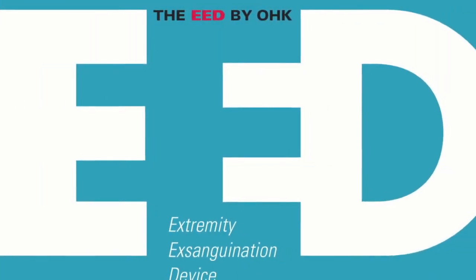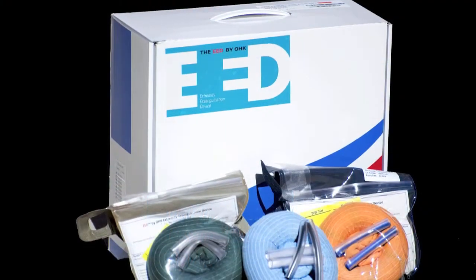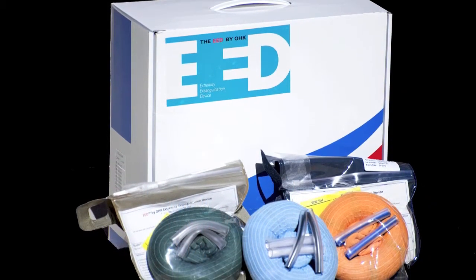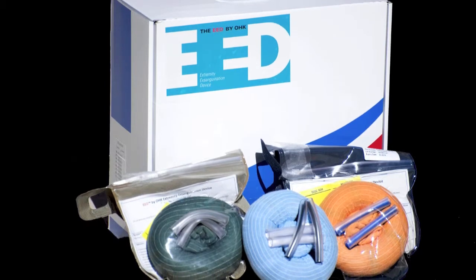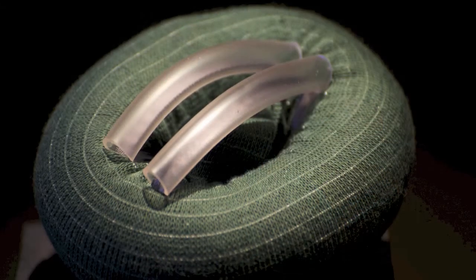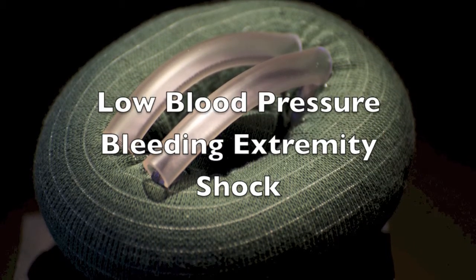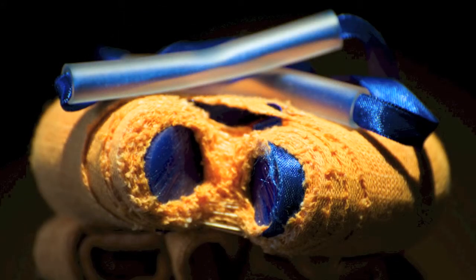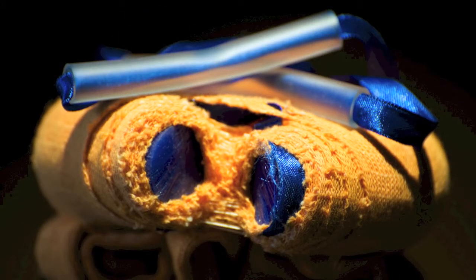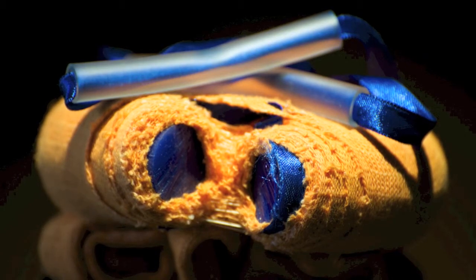Welcome to the Extremity Exsanguination Device, or EED, instructional video. The EED is a non-pneumatic tourniquet and is indicated for displacing the patient's own blood from the limbs to the central circulation and blocking the arterial flow into the limb in situations of low blood pressure, a bleeding extremity, or shock. The EED is a simple device made of a silicone ring rolled into an elastic stocking with rubber handles to facilitate application of the product.